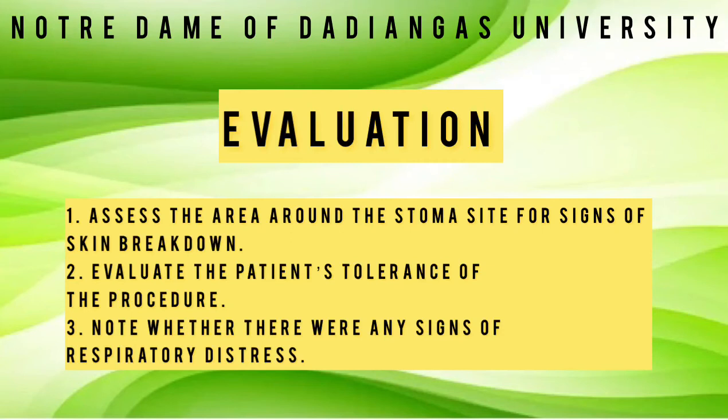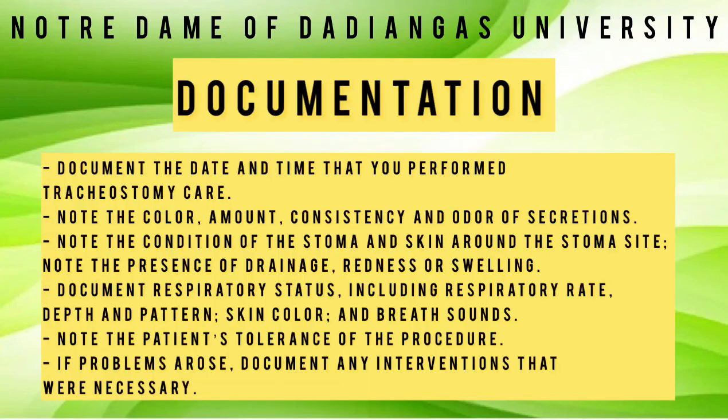For the evaluation, assess the area around the stoma site for signs of skin breakdown. Evaluate the patient's tolerance of the procedure and note whether there were any signs of respiratory distress.